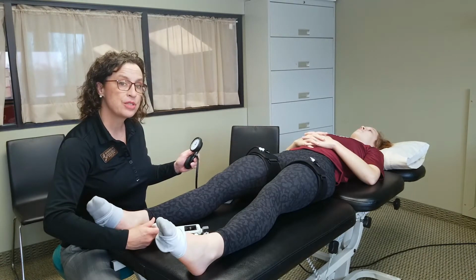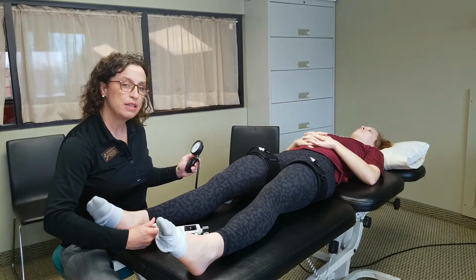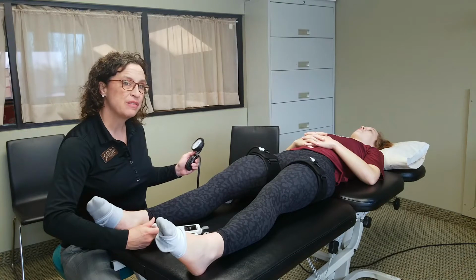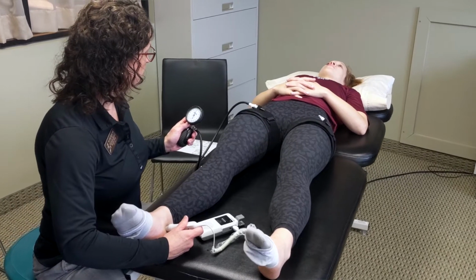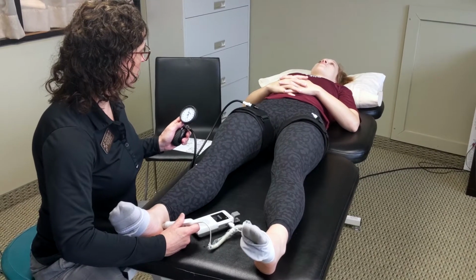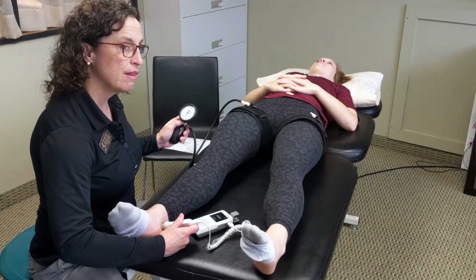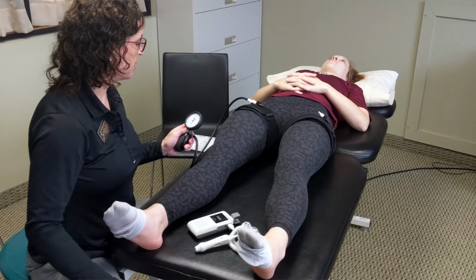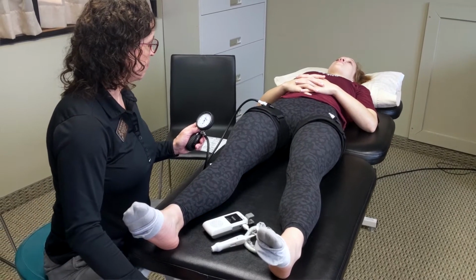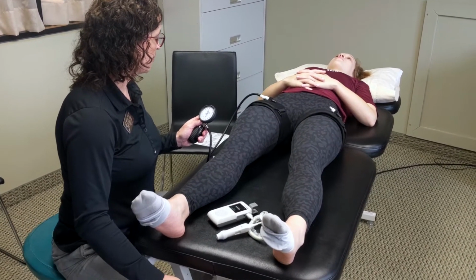Now if she's going to exercise, I'm going to choose something between 60 and 80% in the lower body and 45 to 55, 60% in the upper body. So I'm going to drop this down and you can hear how the heartbeat comes back, but if I pumped it back up to 140, it's gone. So now I know 140 is her 100% occlusion. And now I'm going down to about 120.